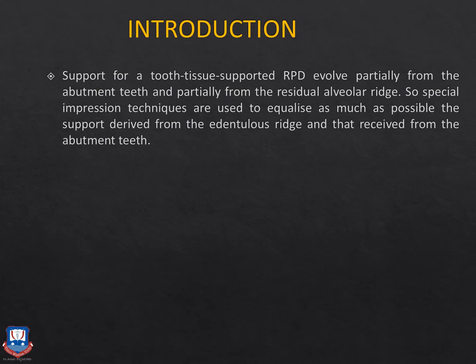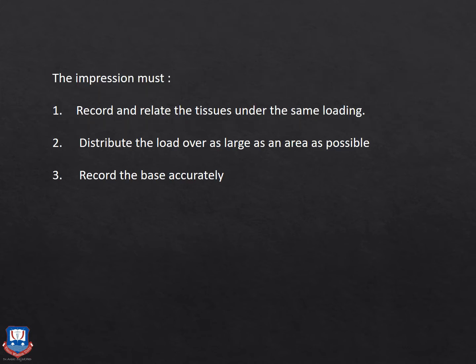Now, the impression that we take for removable partial dentures should record and relate the tissues under the same loading pressure, that is under the occlusal loading or functional loading. Under that condition, the tissues should be recorded.